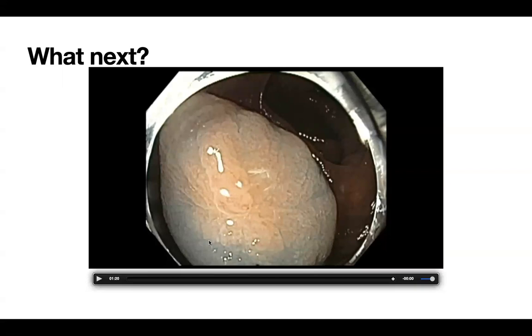So when I started doing EMR, I used to inject on the anal side, whatever is closest. And then I used to create mucosal blebs, and the mucosal blebs make it very hard for resection.